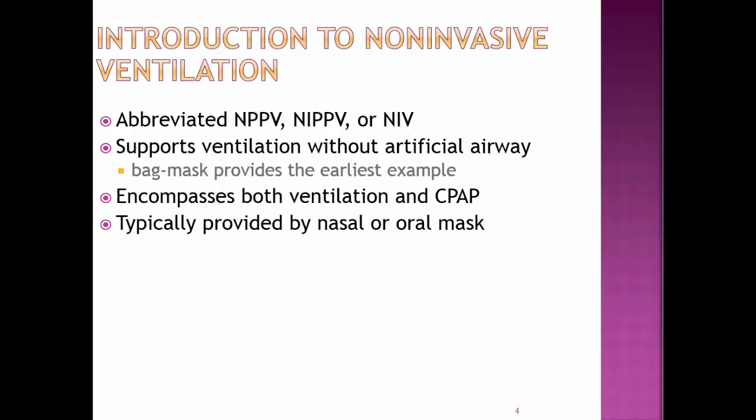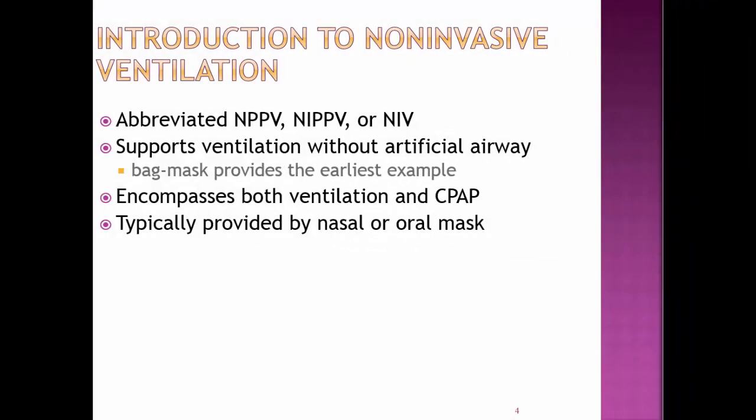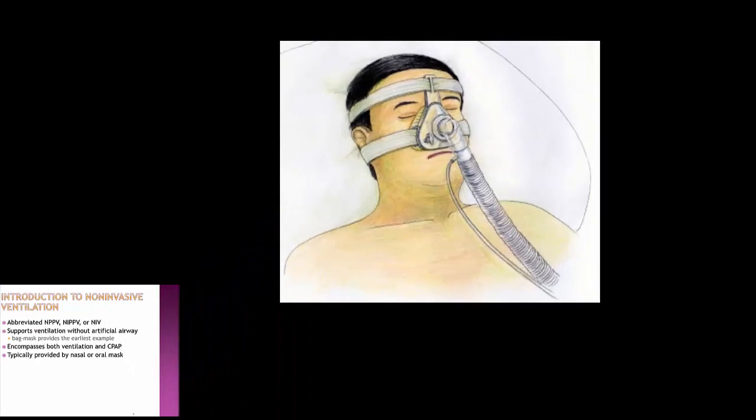You're going to see the term non-invasive ventilation abbreviated a number of ways, so pay attention and realize what they're trying to tell you. Non-invasive ventilation doesn't require an airway. So the earliest example is just a resuscitation bag and mask. This encompasses both ventilation and CPAP and is typically provided by a nasal or oral mask.